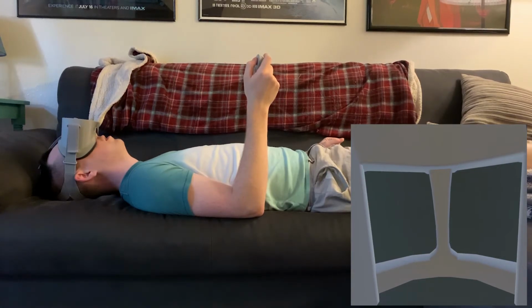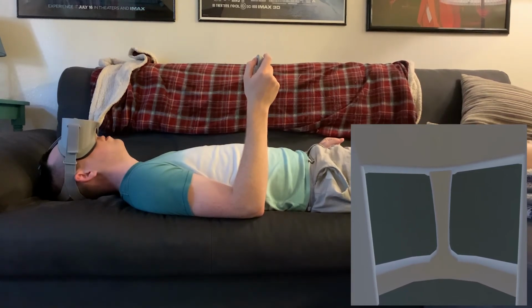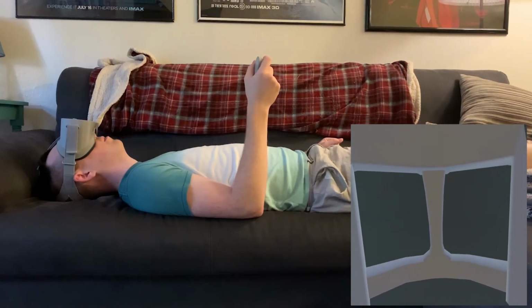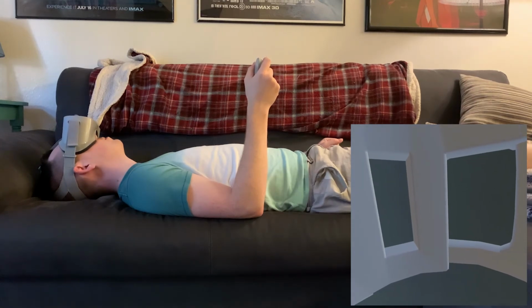All right, now I'm going to go over the instructions for the game you're going to play when you're in the scanner getting your pictures taken. When I start it up, you're going to hear some loud noises. That's completely normal. That's just our camera taking pictures.